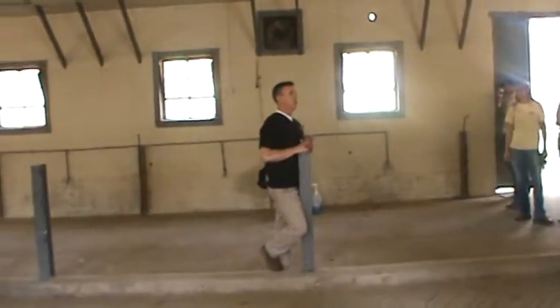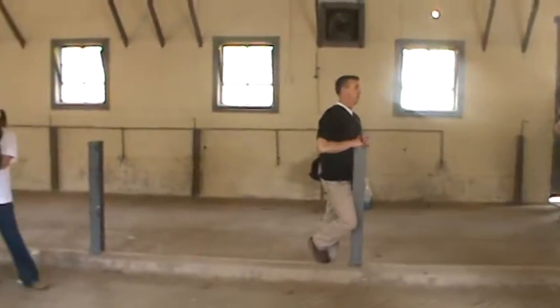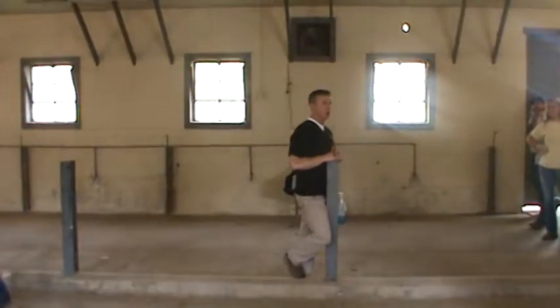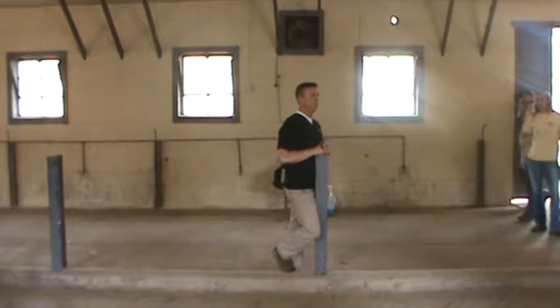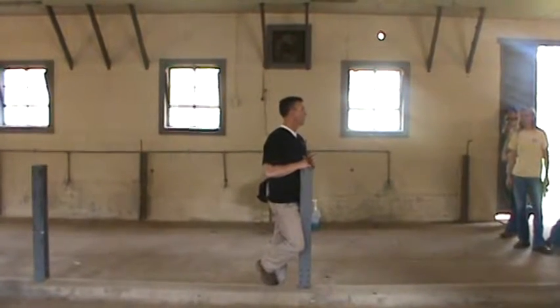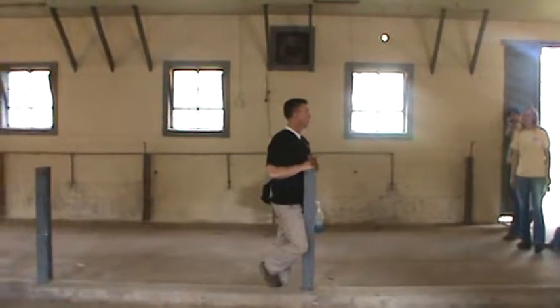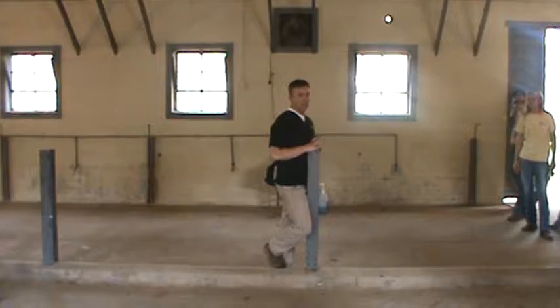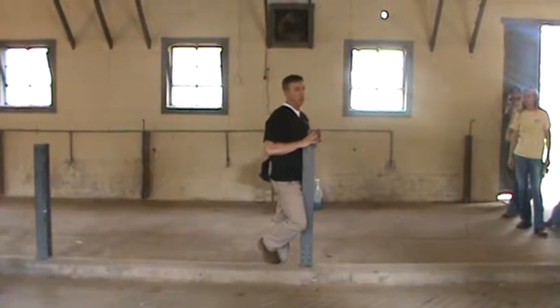As we talked about, there are so many reasons that the horse is unable to carry a baby to term, which creates a question about, is she actually going to be a fertile mare? So there are several things that we could do for a reproductive exam on a mare. I gave her a little bit of sedation. Normally, I wouldn't do that.